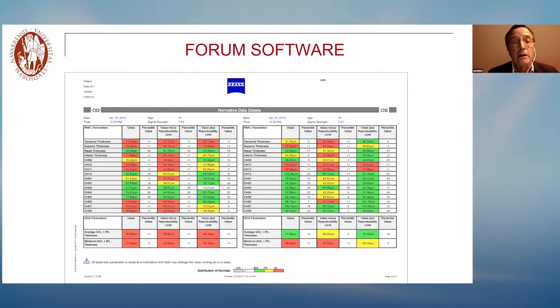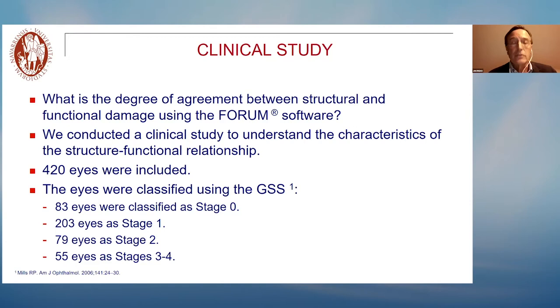The most important question is, how is this software useful for the diagnosis of glaucoma or to make clinical decisions? What is the agreement between OCT and visual field using this program? I would like to show in the second part of my presentation a clinical study that was performed in our Department of Ophthalmology. This study was submitted and accepted in the ARVO meeting this year, but unfortunately, as you know, the ARVO meeting was canceled.